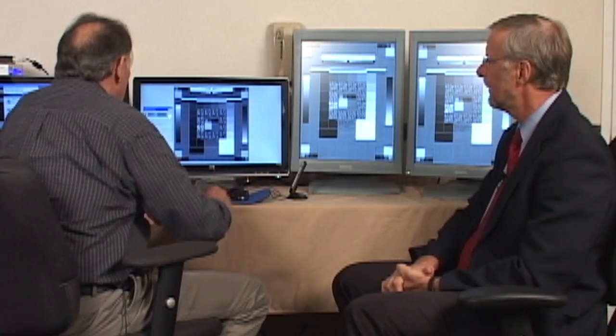What I've done when this is in its enabled operating version, if I do a conformance test on this, what I'll find is that the conformance curve for this display is actually within a plus or minus 10% tolerance, which is considered diagnostic. But you have to keep in mind, because it is a commercial display, it doesn't have the luminance response to create a luminance ratio that's appropriate for medical. Sure. Where we're working with 250 to 350 to 1 ratios with medical displays. A lot of times you're lucky if you can get up to 200 to 1.